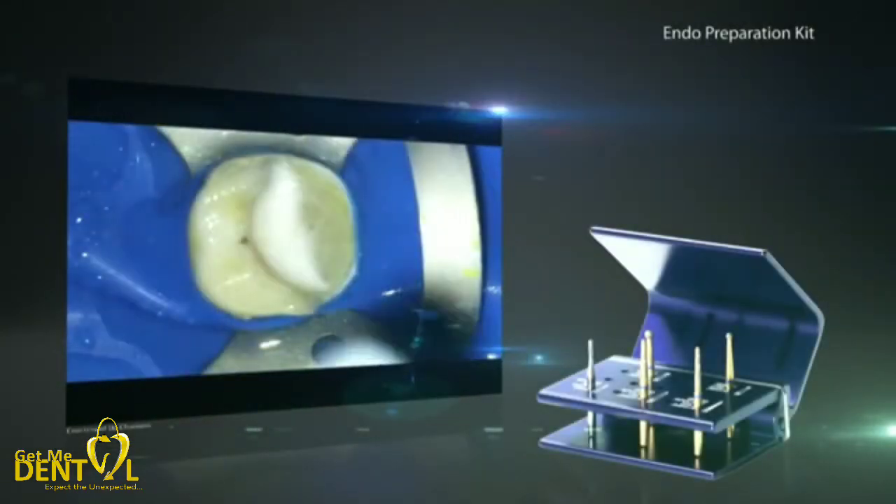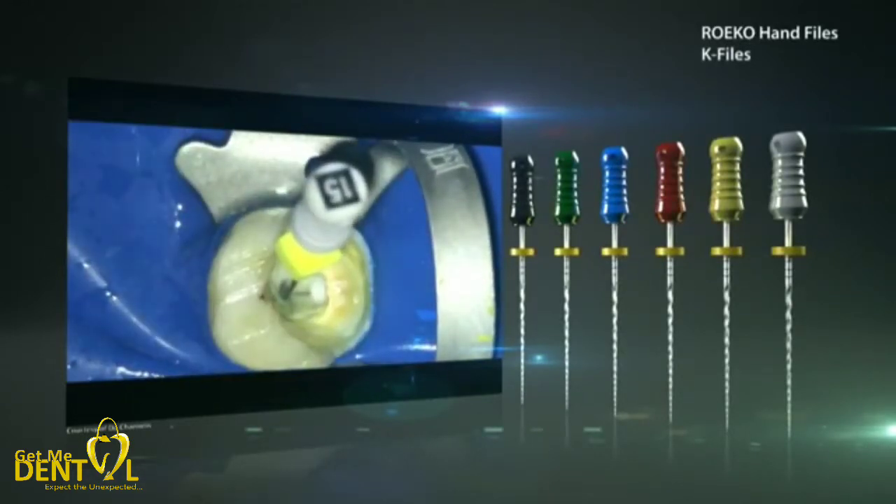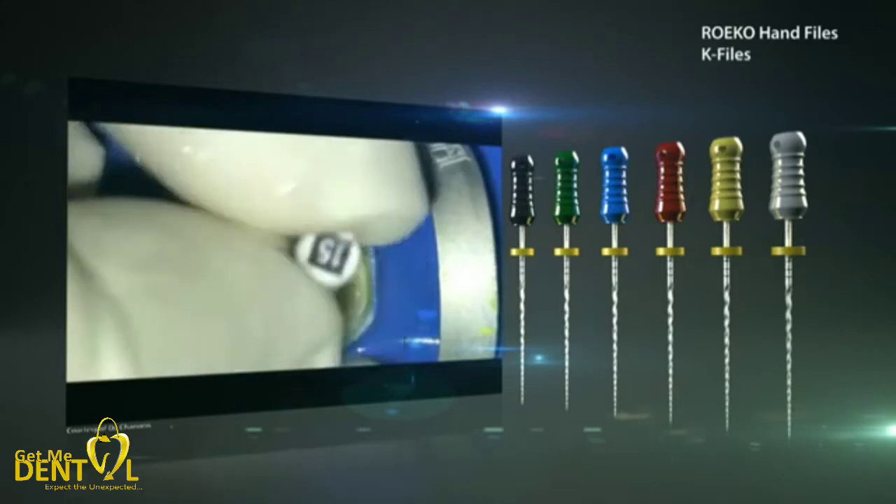Each endodontic treatment starts with the opening of the pulp chamber and the removal of the pulp. Then the root canal is thoroughly rinsed with rinsing solutions, followed by the creation of the manual glide path in combination with the length measurement. Colteam provides all of the necessary products, from rotary burrs to syringes and irrigation tips for rinsing solutions, as well as hand files and apex locators.